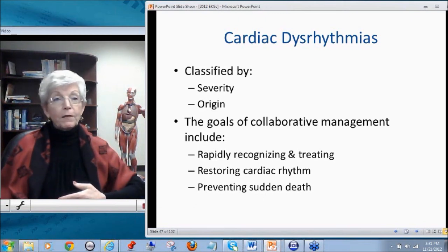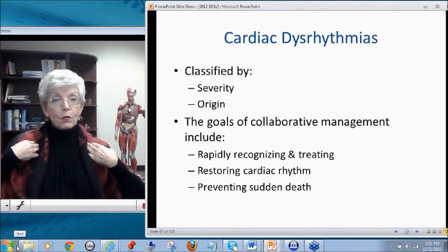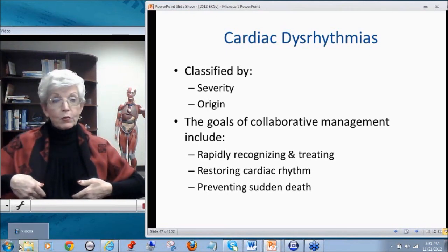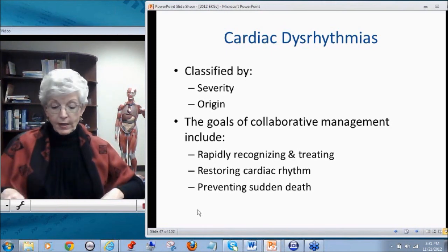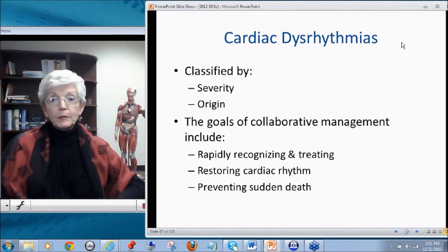Normally, most often, a 5-lead. Instead of having 10 electrodes on the patient, we have 5 electrodes, one in each subclavicular space and one in each inferior costal margin border, and this mimics the 2 arms and the 2 legs. Then we have a 5th lead, which would be the precordial lead, which we can place anywhere we want, V1 through V5. In that particular system, with only 5 electrodes on the patient, we can look for rhythms. It's not diagnostic. It's not a 12-lead to diagnose.